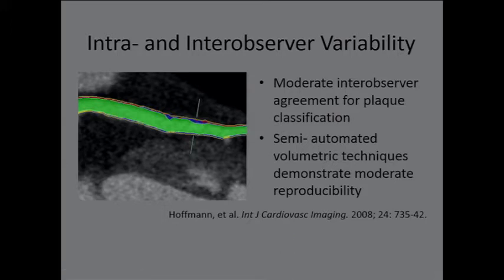The thing that's been alluded to yesterday as well as earlier today is that we don't have any standardized methods for describing these. Although, as demonstrated by our opening case, we are constantly looking at these features and making our decisions as we report our CTAs based on whether or not plaque is real or artifact, and these characteristics can definitely help in that decision. We don't have any standardized methods for acquisition that help us routinely describe and attribute the additional prognostic risk associated with these plaques.